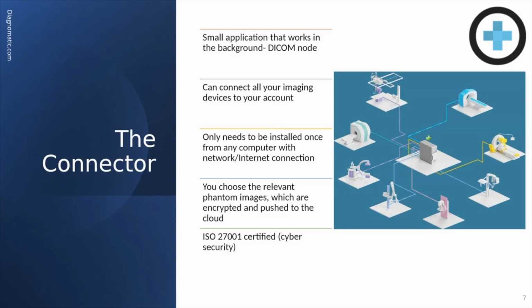The other thing too is you can choose the images that you want sent to the cloud, and it's encrypted. That's what the ISO 27001 certification is for. So the images that you do send will be encrypted. They'll be safe. And so that's always an issue with anything medical IT. It always comes up. So it's always an uphill battle with IT when you start putting images and information to the cloud.